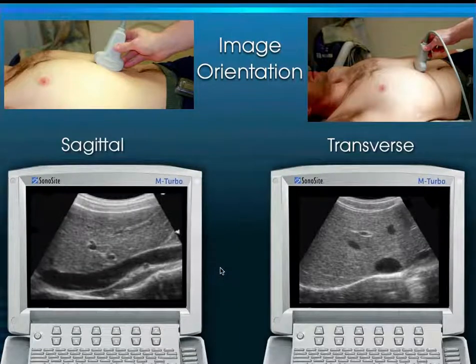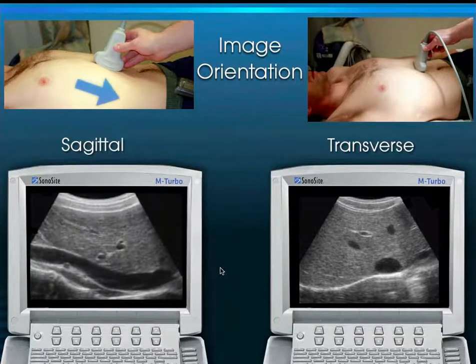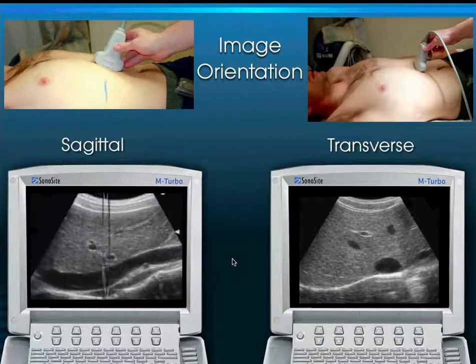But if I accidentally aim the indicator down towards the feet because I wasn't paying attention, now this IVC is upside down. And when that IVC is upside down, while you can still interpret it, it's an upside down image and goes against the convention in the United States. Over time, that appearance should feel like fingernails on a chalkboard to you. So I'm going to turn it back right now because it's having that effect on me.